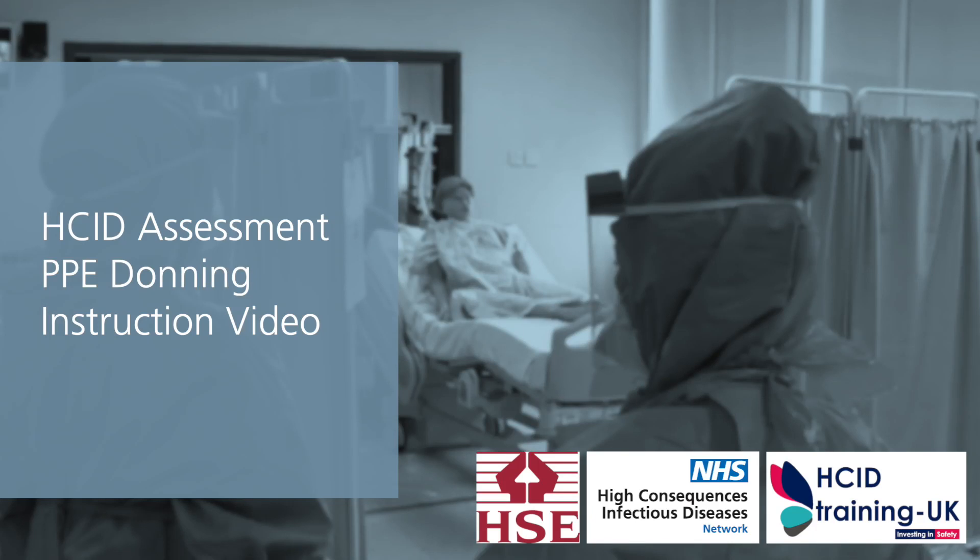This video provides instruction on how to safely don the High Consequence Infectious Disease Assessment PPE recommended for use when assessing patients with suspected HCID in the UK. The HCID Assessment PPE was developed by members of the HCID Network and the Health and Safety Executive, and provides an evidence-based high level of protection against pathogens which transmit by airborne and contact routes.